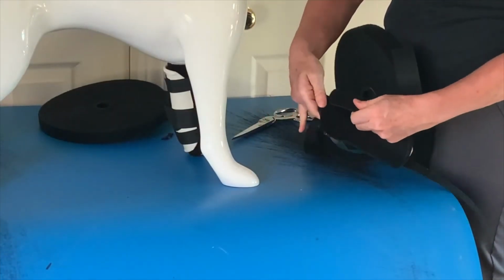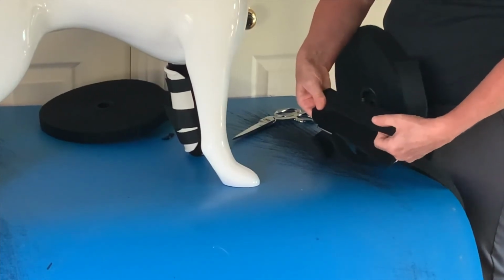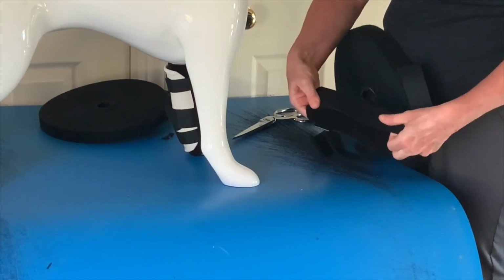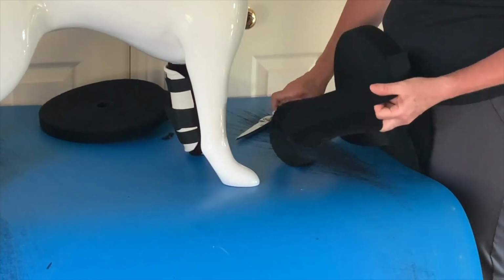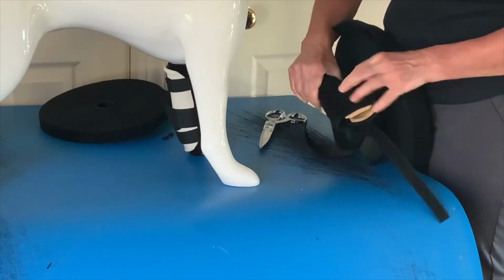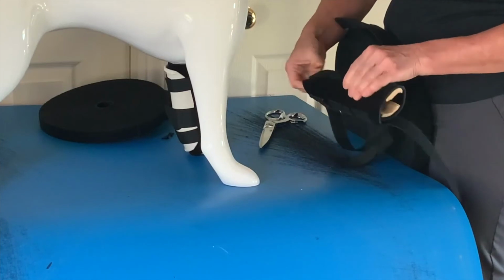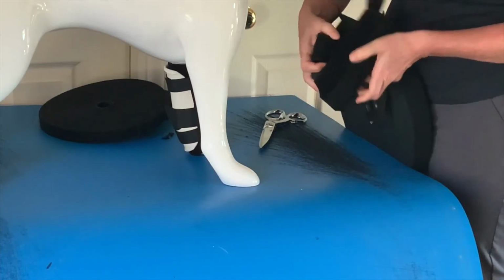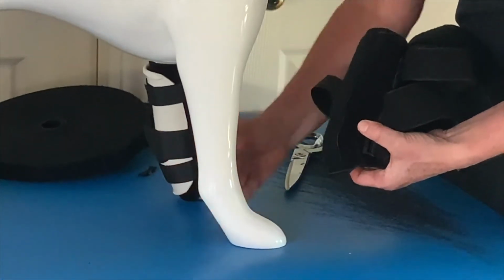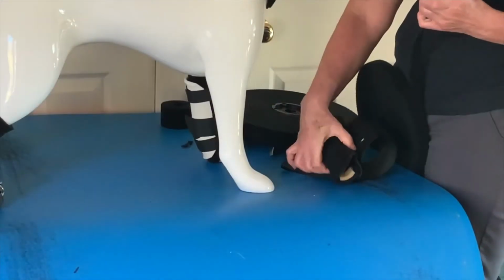Now to add your support straps. Support straps can be added in any direction and can be layered depending on the need of the pet. Support straps can easily be applied and removed as needed, making one brace quite versatile in its level of stability. Support straps can also help to shape the brace.